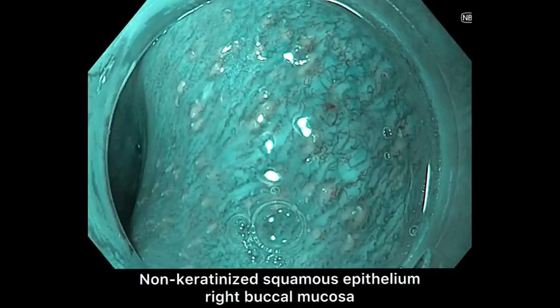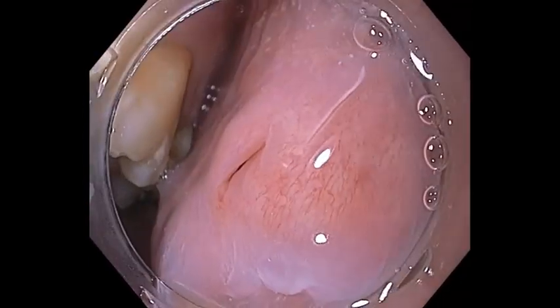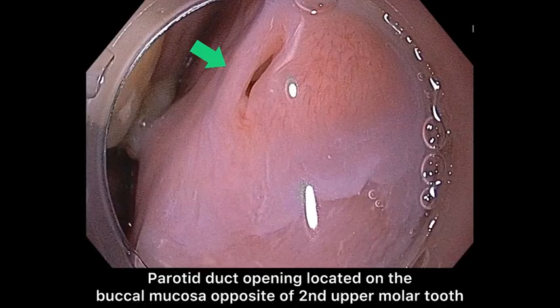This is non-keratinized squamous epithelium of the right buccal mucosa. The parotid duct opening is located on the buccal mucosa opposite the second upper molar teeth.